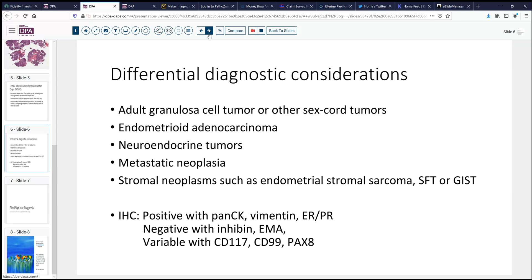The differential diagnosis can include adult granulosa cell tumor and other sex cord stromal tumors. Endometrioid carcinoma is a consideration, as these tumors will stain with keratins and vimentin, as endometrioid tumors might. The Pax8 staining was less than would be expected, but the P16 pattern was also similar to what can be seen in some endometrioid adenocarcinomas. Neuroendocrine tumors were excluded as it was uniformly negative for synaptophysin and CD56, and metastatic neoplasia from other organs was also considered. Typically it will be positive with pan-CK, vimentin, and hormone receptors, but negative with inhibin and EMA, and variable with other markers.